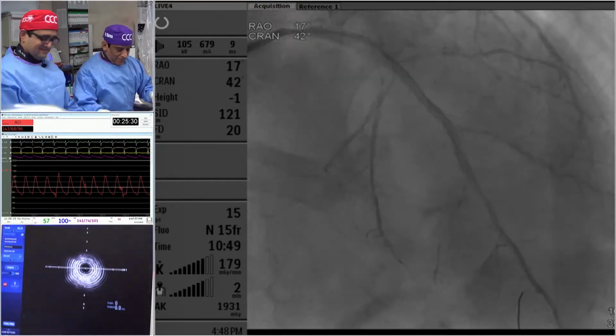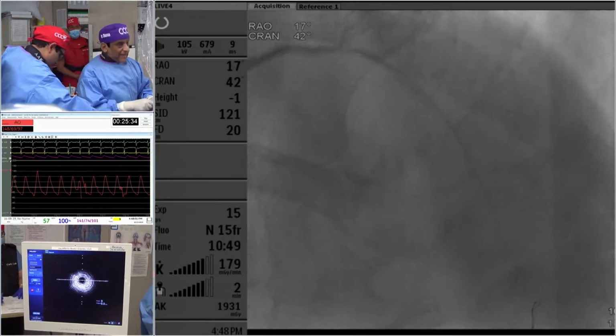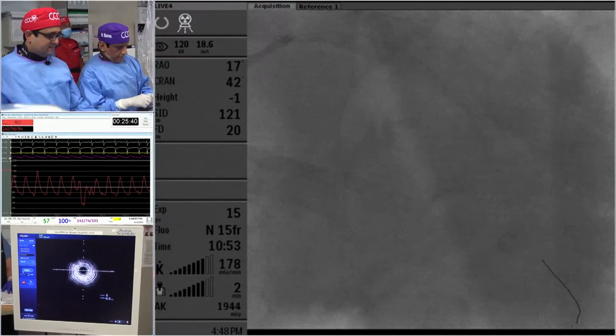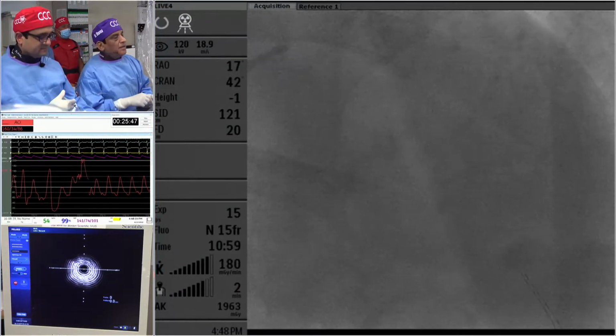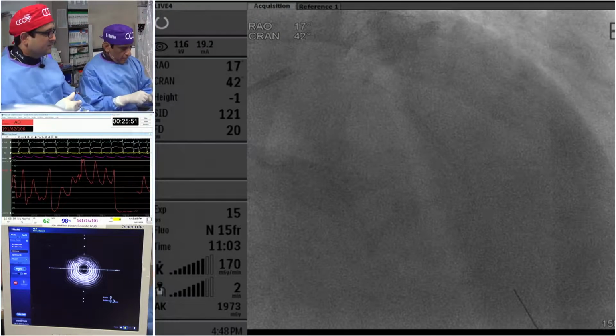So don't ask me to. Tell me the story of this lesion up there, that imaging filling defect. Is that from the beginning, the first time? Always. No, not at the earlier angiogram. Earlier angiogram, yeah, from the beginning. So this has to be a dissection. Yeah, an ulcerated plaque. It might have happened, but it was there right from the beginning. Good. Fine.